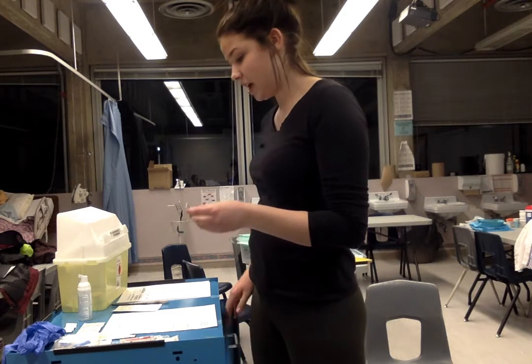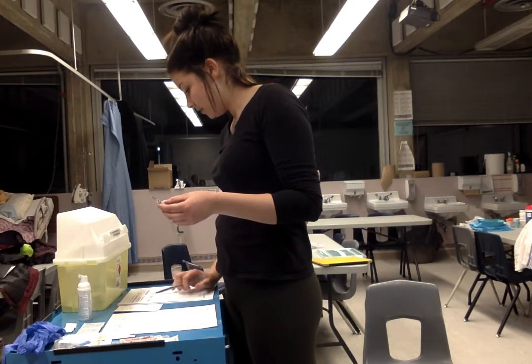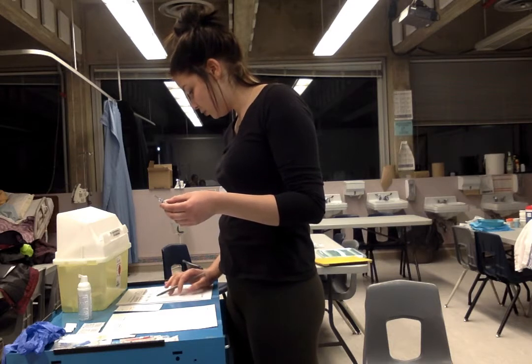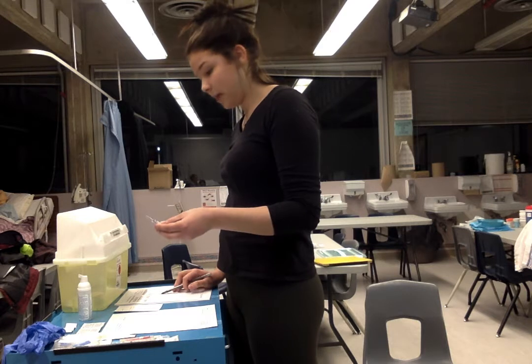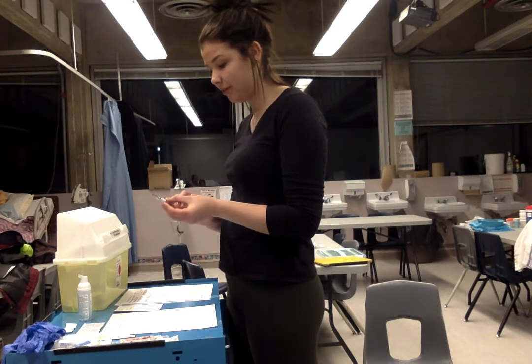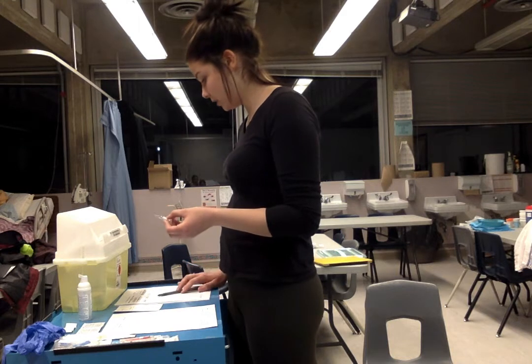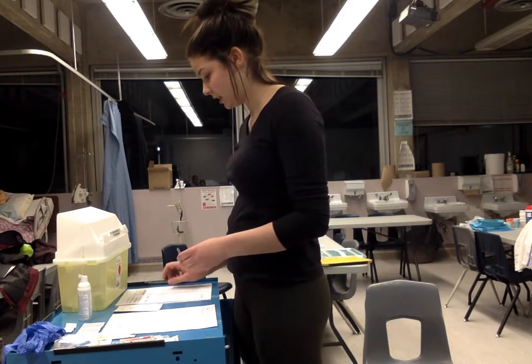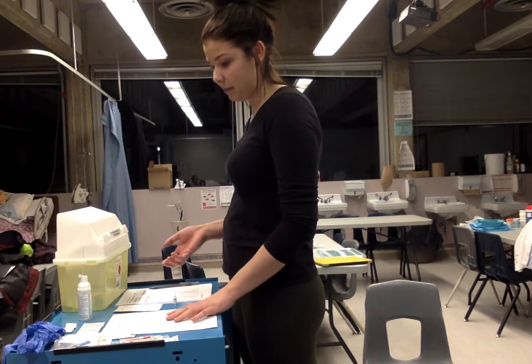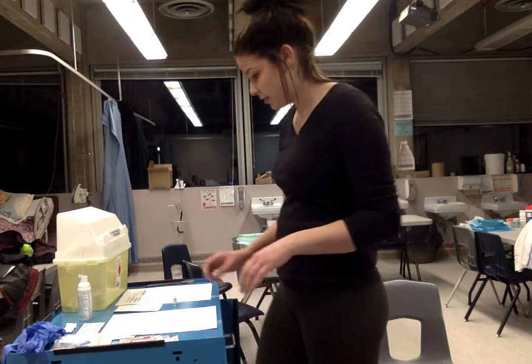So I have this. Now I need to do my first check to my MAR. We have morphine, 10 milligrams per ml, and here we have morphine, 10 milligrams per ml. So that's the right drug and the right dose. And we are giving it to Rupinder Appendi, and we're giving it by subcut line. It's a PRN, he's having pain, so we're giving it for the right reasons, to the right person, right time, right drug, right route.